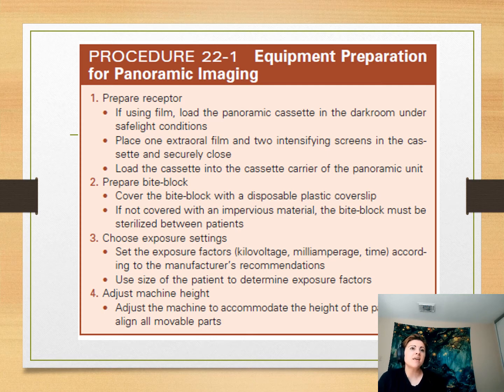Okay. And then choose exposure settings. So you need to make sure that most of the time you can't change your kilovoltage or your milliamperage on a pano, but you'll change your time depending on the patient's manufacturer settings and depending on the size of your patient.